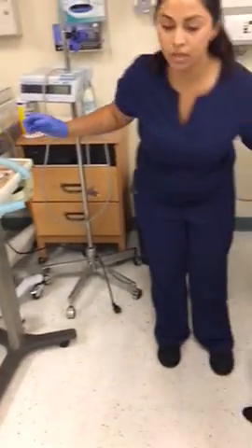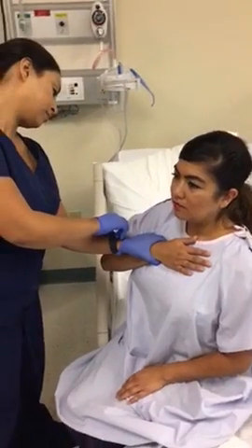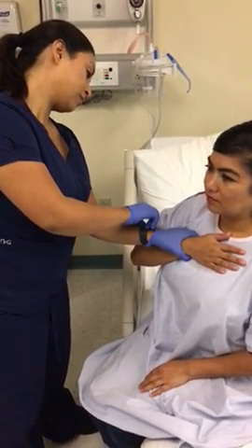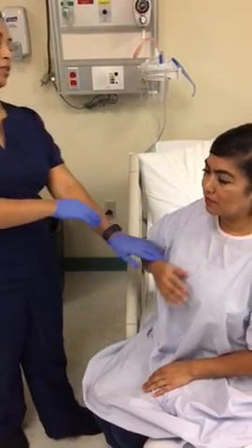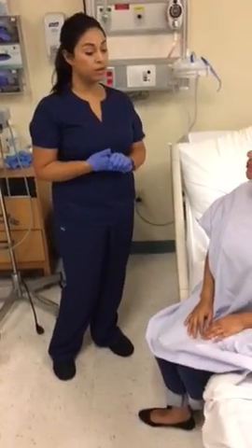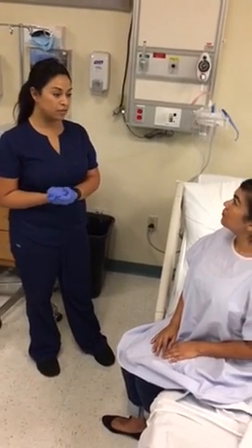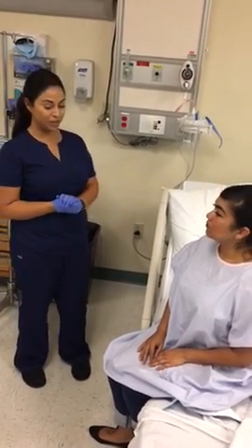And next I'm going to be checking your heart rate. Okay, you can go ahead and relax your hands. So your heart rate and your respiratory rate are within normal limits, and I'm looking at you and you have no sign of respiratory distress, no accessory muscle use, or any cyanosis, so that's very good.